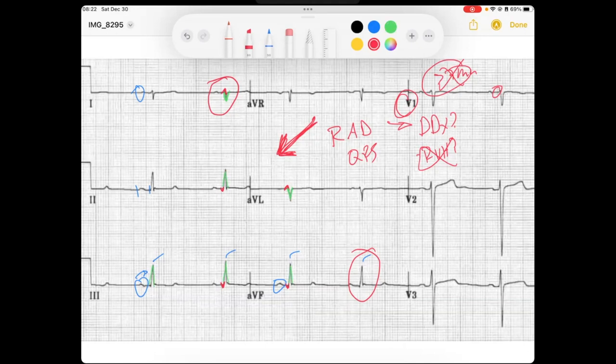And so because we've ruled out other causes of right axis deviation, and this fits the morphology that we would expect, we can say that this is a left posterior fascicular block.